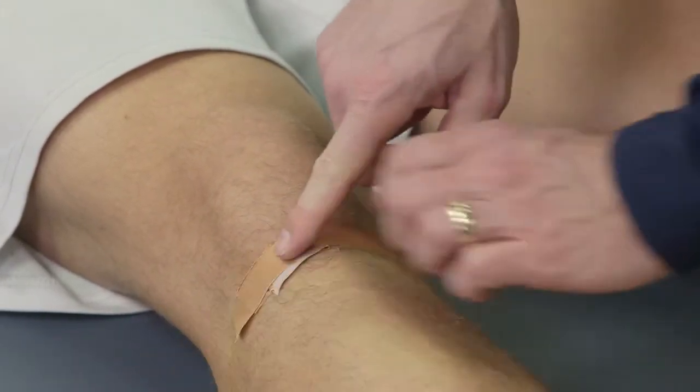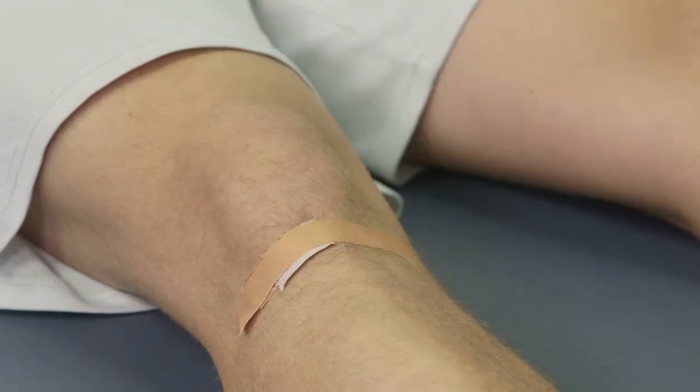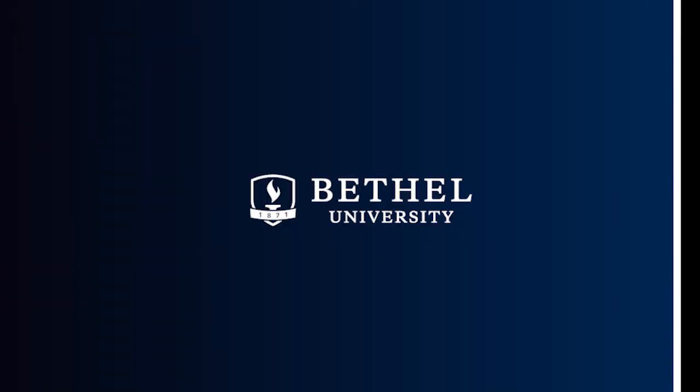When he moves, that puts pressure directly onto the patellar tendon and therefore is going to alleviate some of that patellar tendonitis pain. A very easy thing to do — fairly simple, but many times can be very effective for somebody that's got patellar tendonitis.